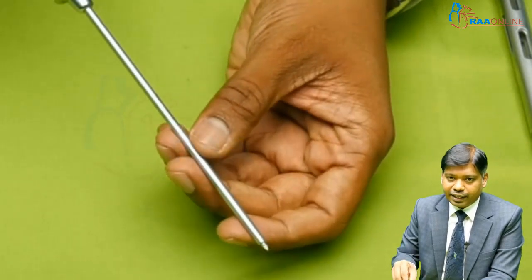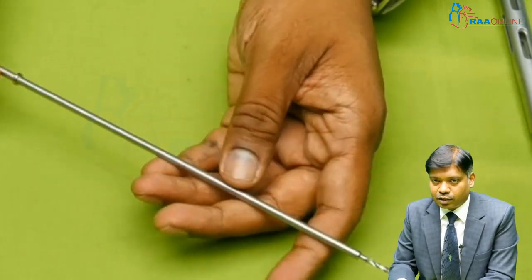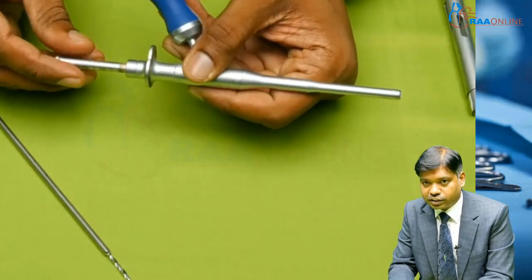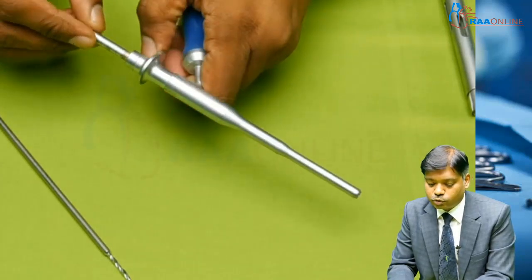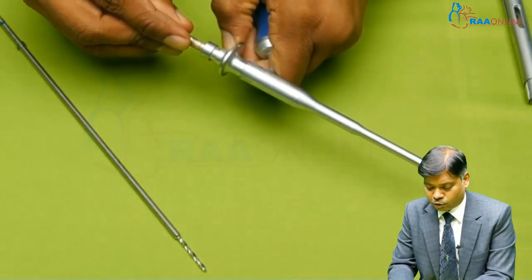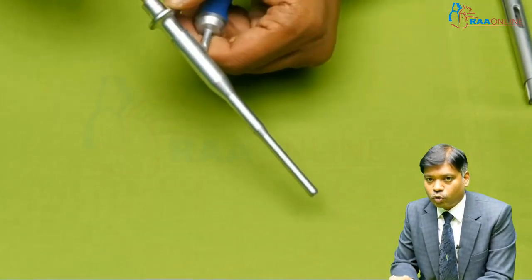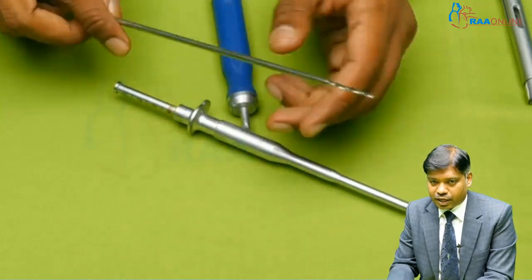Once you make an entry or starting point, for the next instrument you can use either a thin probe designed for the cervical spine, or this drill. This is the drill, and you have a sleeve for the drill. The main advantage of this sleeve is you can see the markings here. These markings are very, very important. For a lateral mass screw, usually we use 16 to 18 mm. So you push this and adjust the markings, and place it over 18 mm, and then if you insert the drill, you can see it will not pass beyond that, because you should not go very much anteriorly and hit the vital structures.